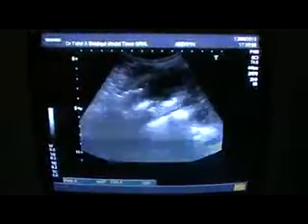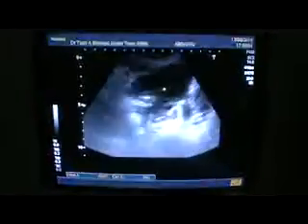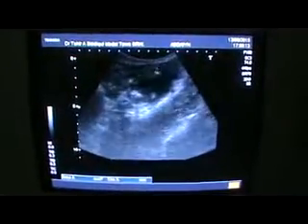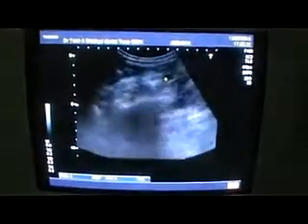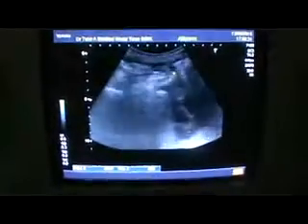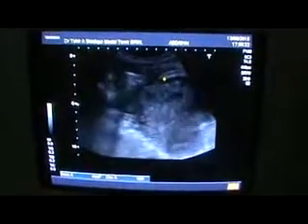And now we are in the region of the left adnexa. See the echogenic material within it, this is all echogenic material. This is a fluid component, again seen in the region of the left adnexa. All types of septa, thin, thick, incomplete, complete, as well as fluid component. Now this is fluid, this is all fluid, and this is thick mesentery seen also. Adhesions are seen, and this is the area of the left adnexa.